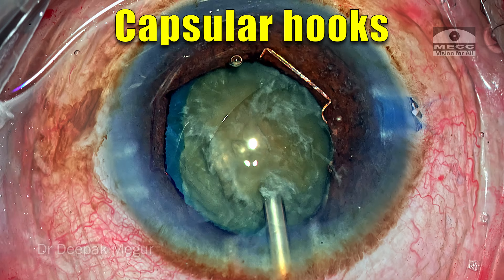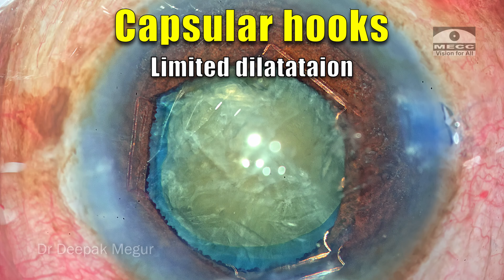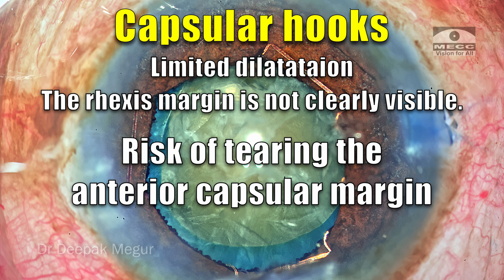Ideally, one can consider using capsule hooks to stabilize the bag, but in situations where pupillary dilatation is not extremely good, I am skeptical of using capsule hooks because visualization of the capsule edge is not great. There is always a risk of tearing the anterior capsular margin, especially in these hypermature long-standing cataracts where the anterior capsule is somewhat flimsy. In a young, healthy patient with localized subluxation, capsular hooks are relatively safer to use.